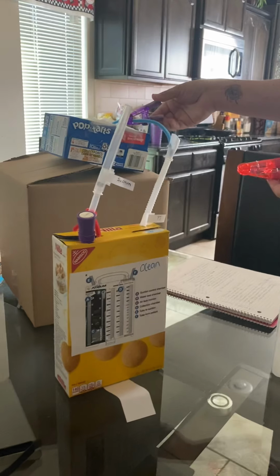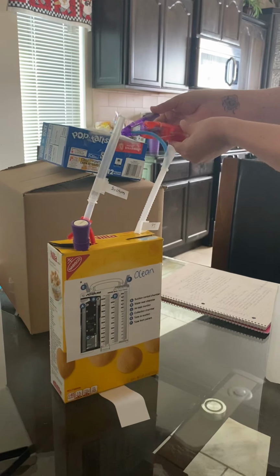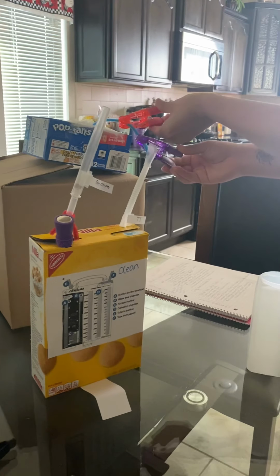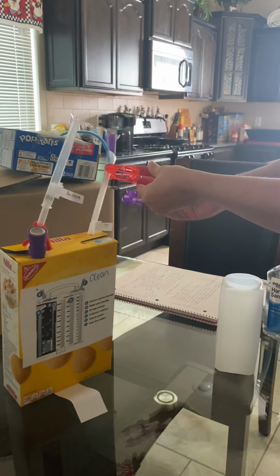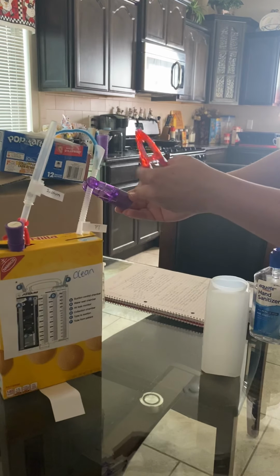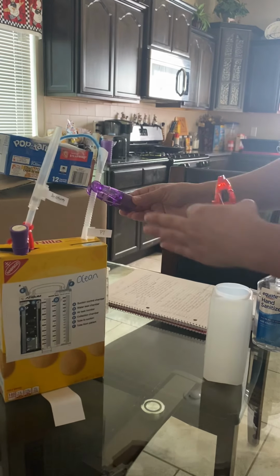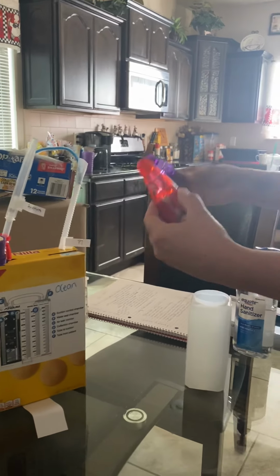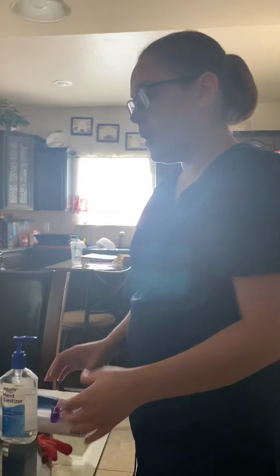So you're going to want to clamp, and then the tidaling doesn't stop, so you're going to keep going down and unclamp, and you're going to keep going down, and then finally the tidaling will stop, and so you know that the air leak is in the drainage system and not from the patient. So you're going to unclamp, you're going to call the doctor, you're going to give the doctor an SBAR report.